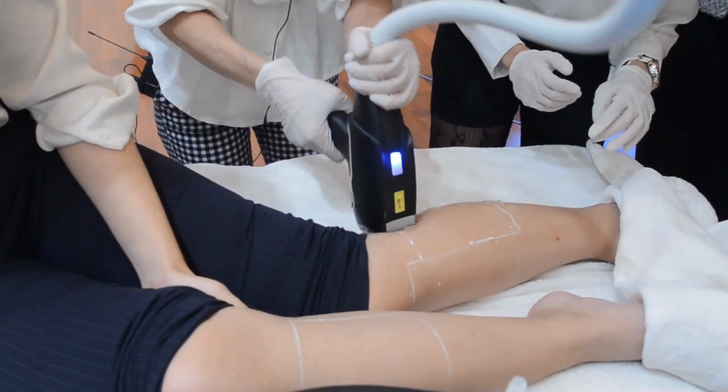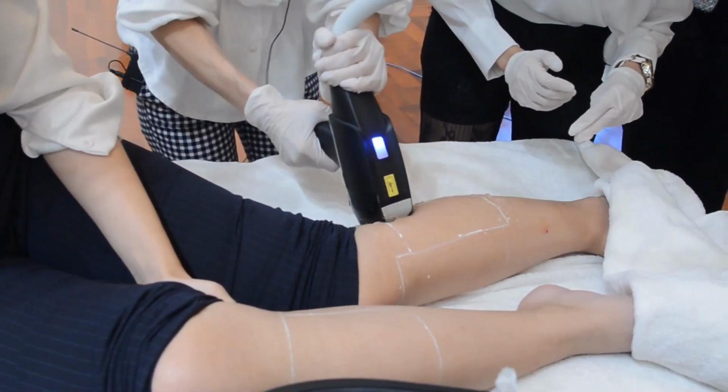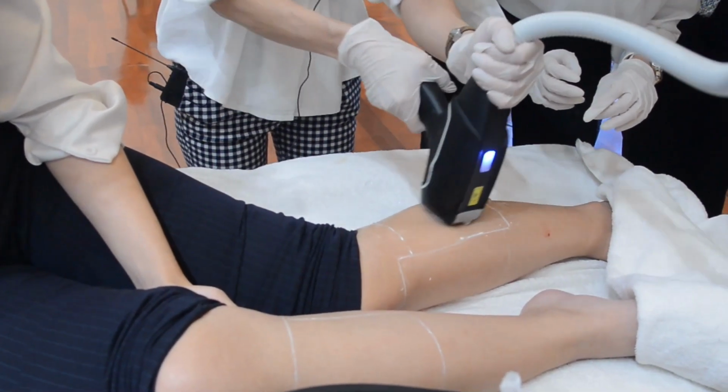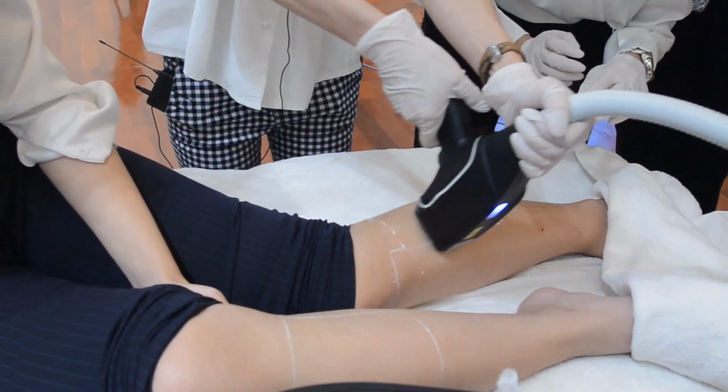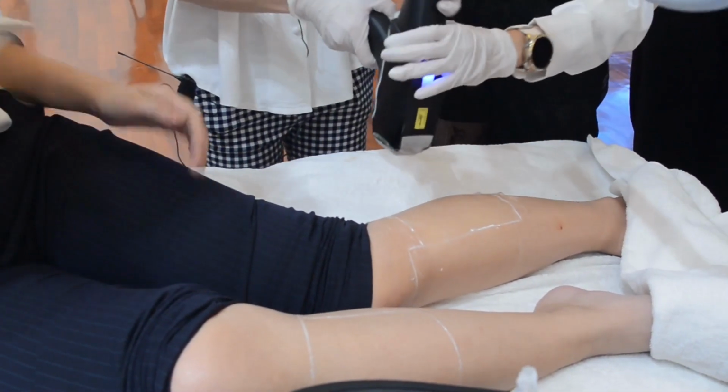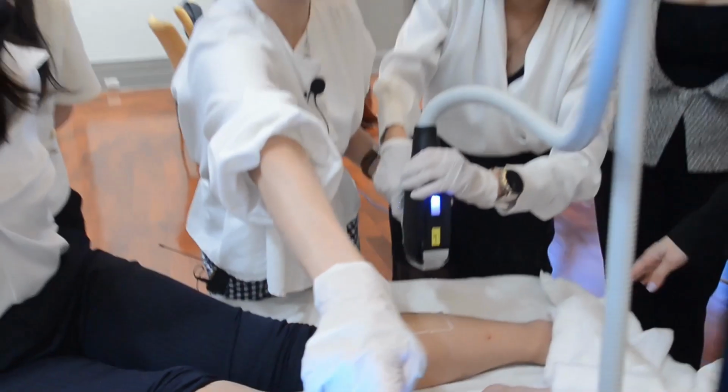So like I mentioned, your wrist has to be very flexible. When you are going down, your wrist also moves down. You see? It has to be. You cannot do this like that. Then she will feel the burn. Okay, try again because we are not completed yet.